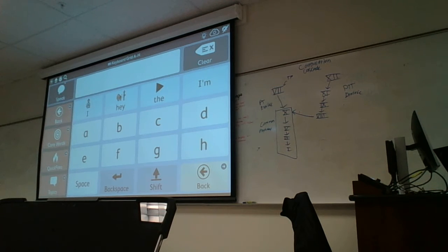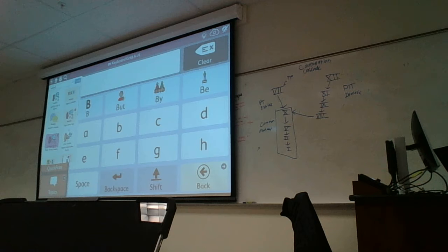Another feature within Snap Core First is this magnifying glass. What that allows you to do is search for things that are on here, which I've personally used as well. Sometimes you're showing something to a client and they talk about, oh, I like bubbles or something like that. And then you want to get to that certain area, right? So this gives you the different categories or different lists of where that word is.